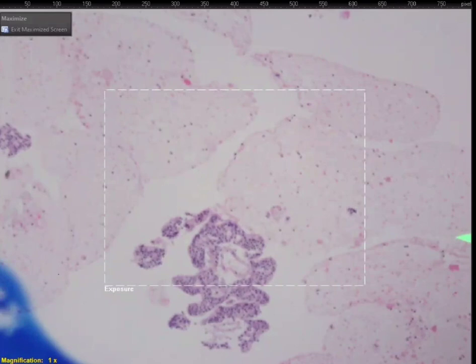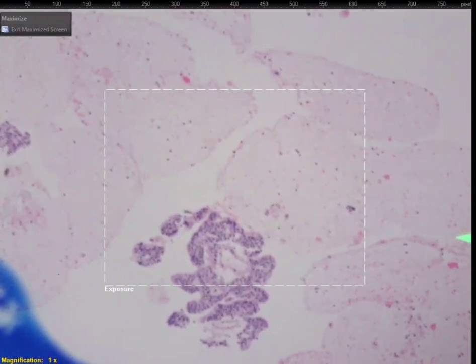We call it metastatic adeno, prostate primary. Prostate primary. We just said metastatic adeno on cyto, absolutely. But the primary is prostate. So again, they probably did immunos on this thing.